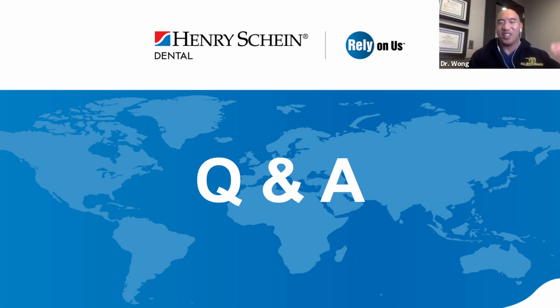And not only is it not good to go, unlike the ISQ test where you just wait a little bit longer, you actually ruin the whole thing because you reverse torqued it and it moved. So that's why it's an all or none type of test. But that's a very common one that they've used and promoted in the past. I wouldn't recommend doing that as your go-to.